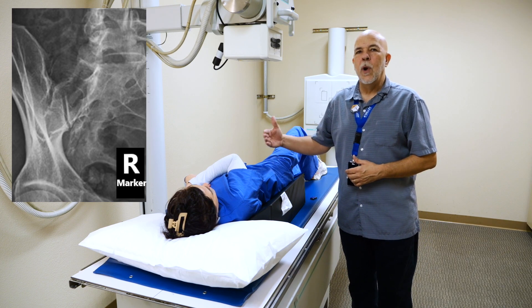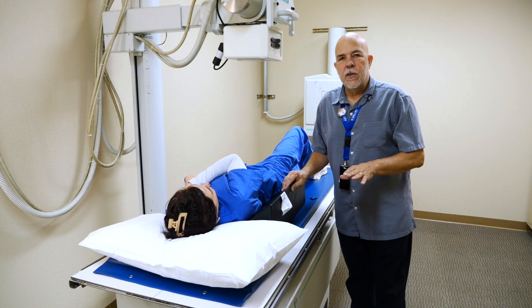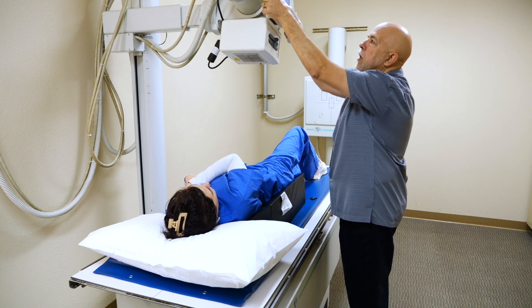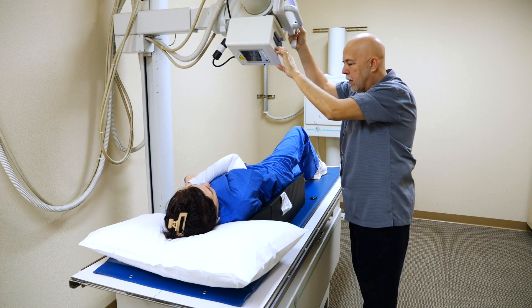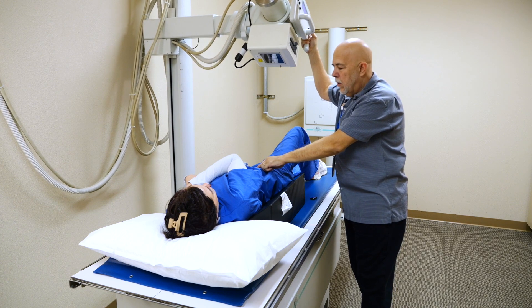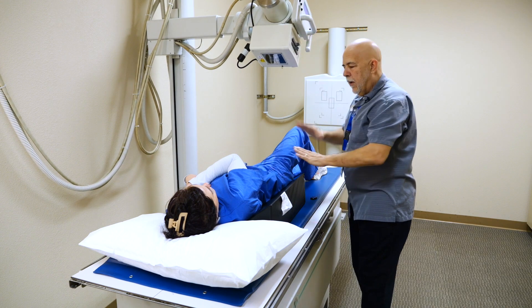You're always going to image the side that is away from the IR doing AP. There is an alternate to this — you're doing the exact same position, except you angle the CR 20 to 25 degrees cephalic. You center one inch medial and one and a half inches inferior to the ASIS. Everything else is the same, and that is the SI joint with the alternate view of the cephalic angulation. Made easy with the Penumbra Brothers.